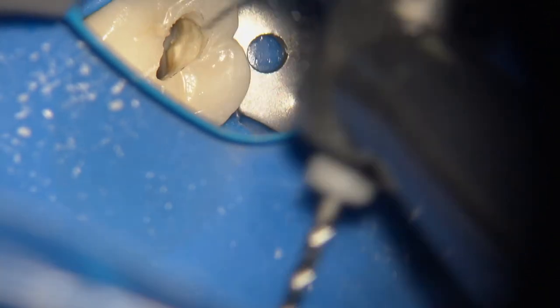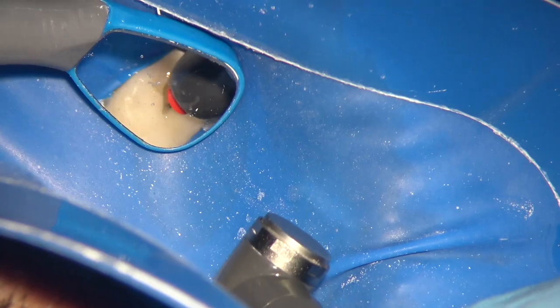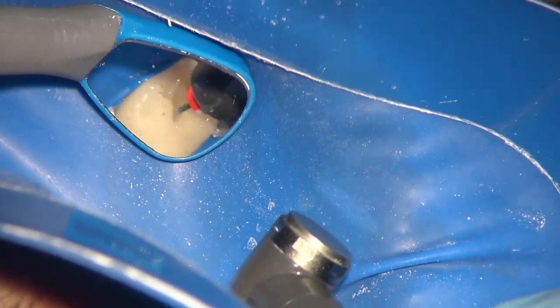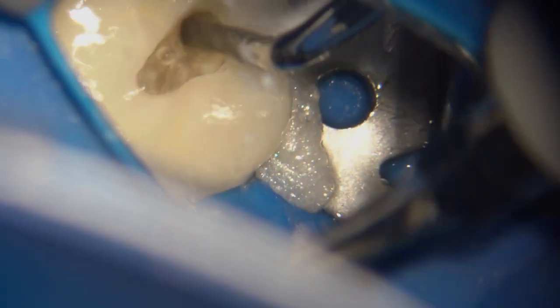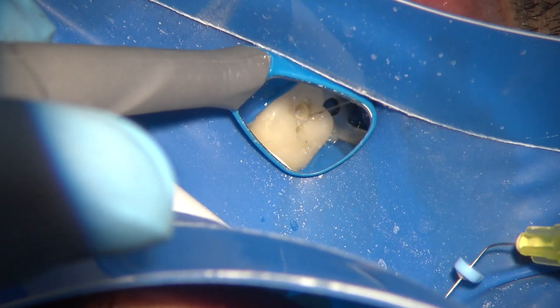For these emergency patients under current circumstances, time and speed are of the essence. The canals were identified using 06 taper files — sizes 15, 20, and 25 — and then at the very end, because the apical diameter was likely a little larger, I used the 3D Shaper size 30 for additional cleaning. Between instrumentation I'm using the ultrasonic with lots of water volume, plus hypochlorite with both negative and positive pressure to wash out debris.